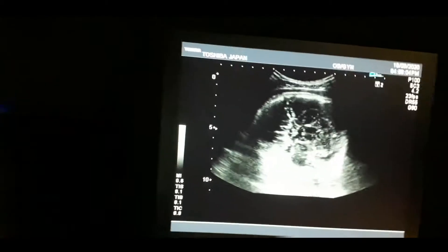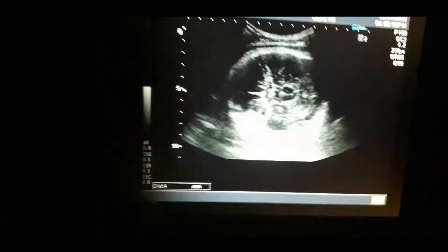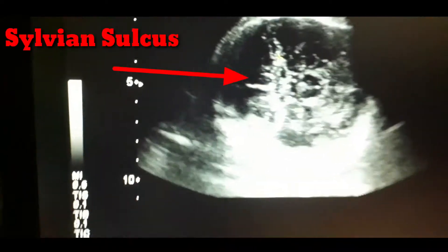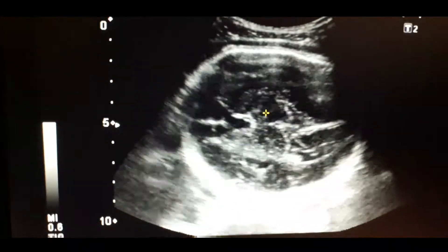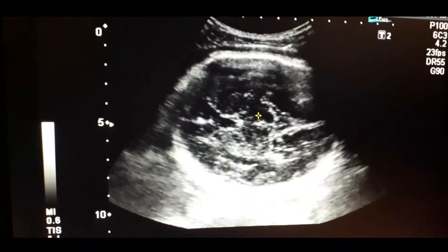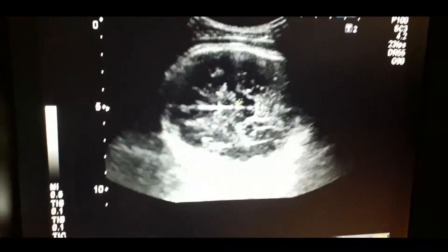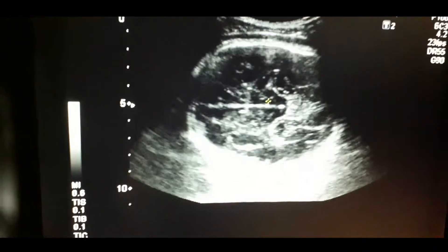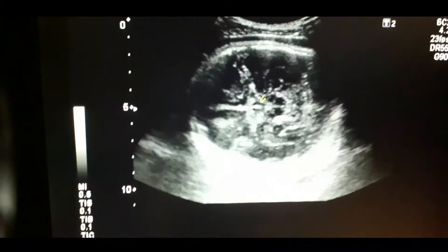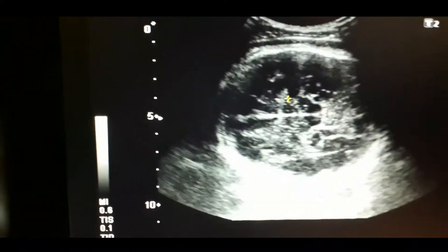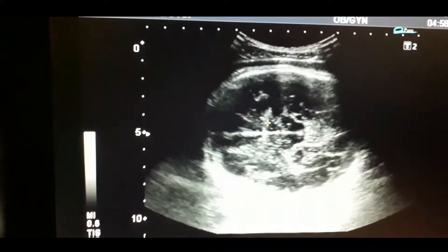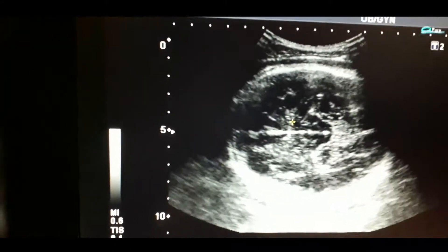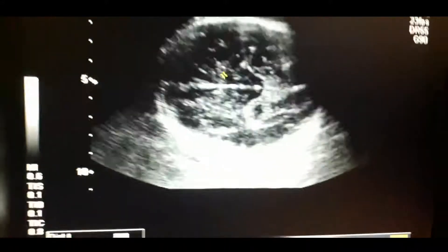Coming to the live case, first I will like to focus on the sylvian sulcus that is present at the base of the thalami. You will like to see the middle cerebral artery at this point — you can follow the direction of the cursor.